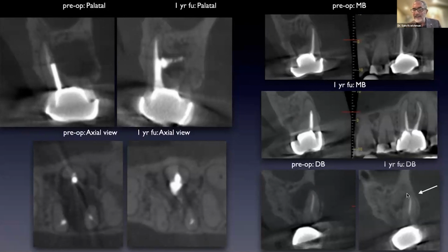The distal buccal healed. You know what that means? That the whole lesion was actually coming from the palatal going towards the distal. And I said, Tom Root, I'm sorry, you did too good of a job, you can't do surgery because you got it to heal. So as much as she wanted to do surgery, obviously I'm not going to let her do surgery.